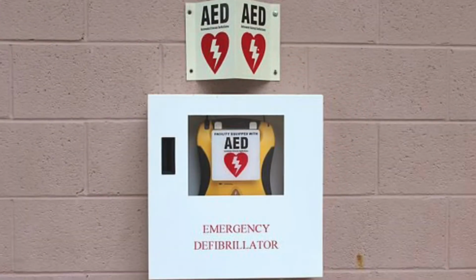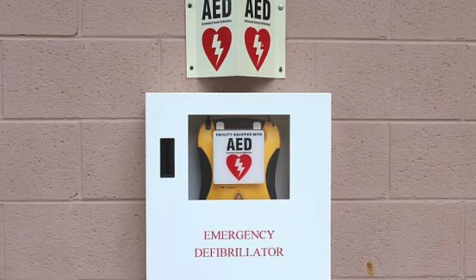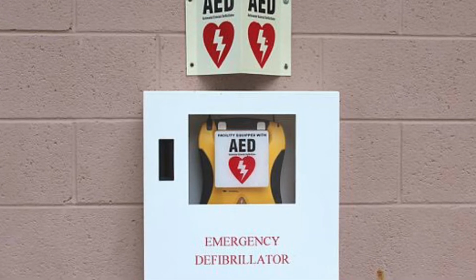Victims of sudden cardiac arrest can be brought back to life by providing chest compressions and early defibrillation with an AED. But both must be started immediately. Every second counts. It is important to know where the closest AED is kept, and many venues have signs pointing to their AED. As I said earlier, using an AED is easy. Just watch as I show you the step-by-step instructions for using one.